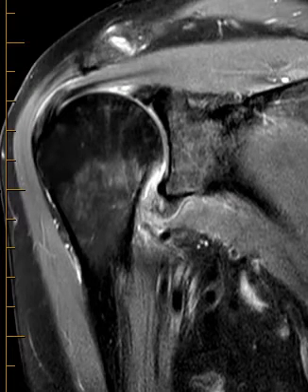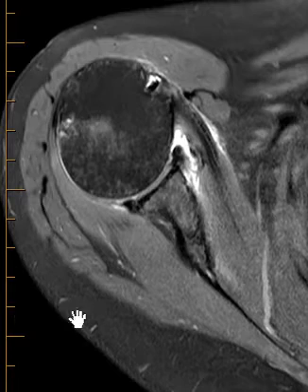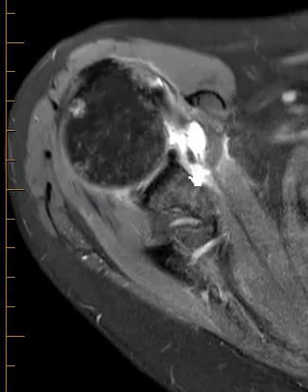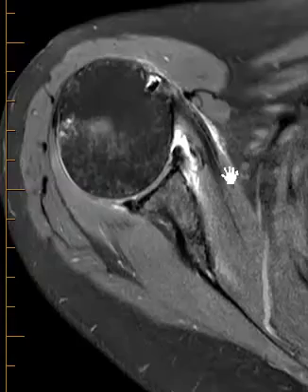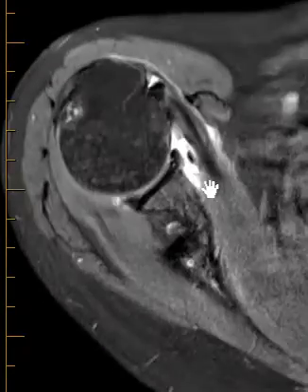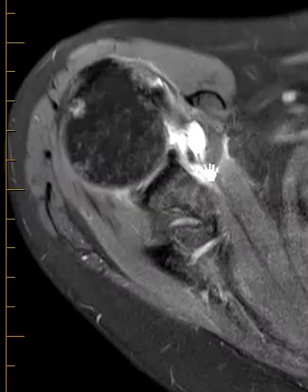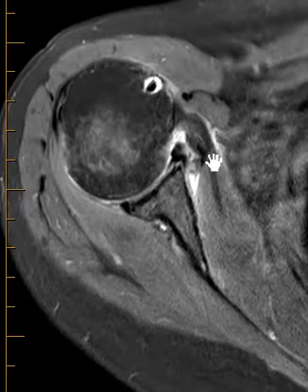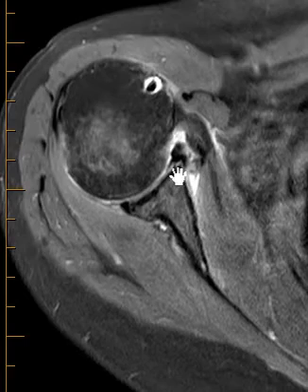Let's put up another view so we can see that on the axial images. The middle glenoid and humeral ligament is this little dot right here — this is axial, so it's a little dot. The middle GHL goes down and blends with the subscapularis here along the undersurface. That looks intact. Up high it looks okay, down here it blends and looks good. So that is okay — the middle glenoid and humeral ligament — but now we see a problem deep to that.